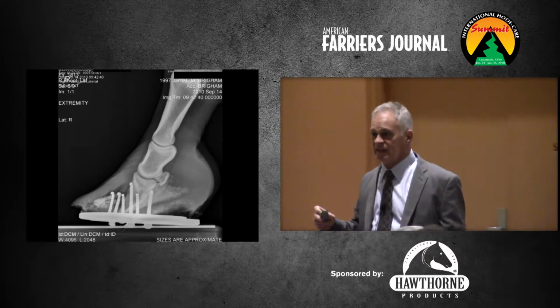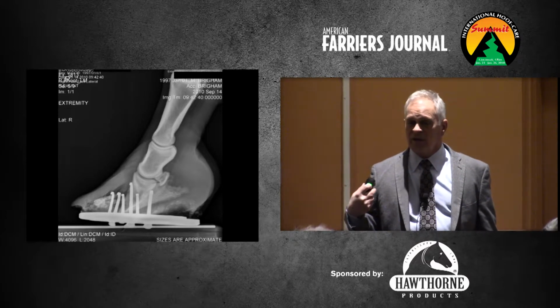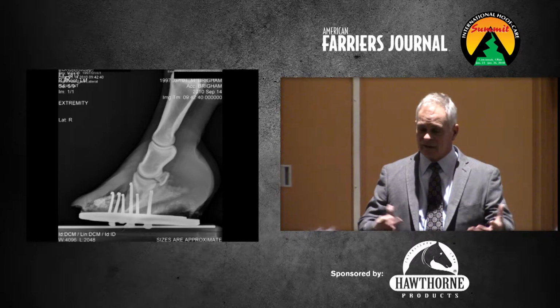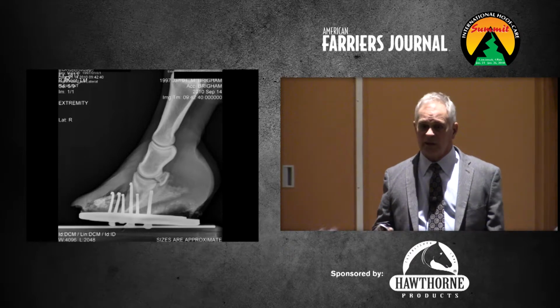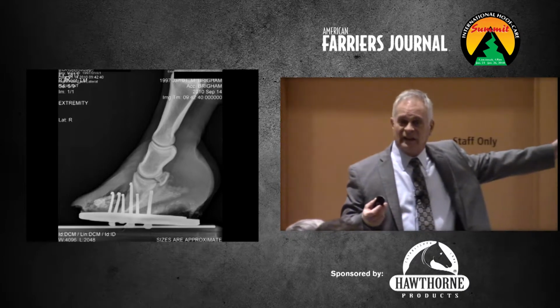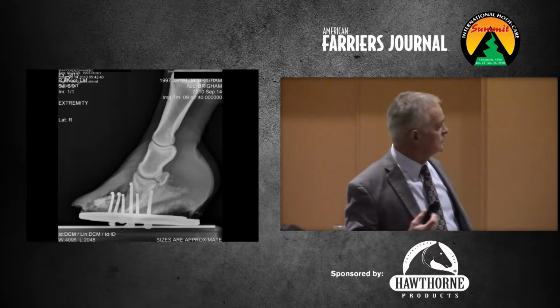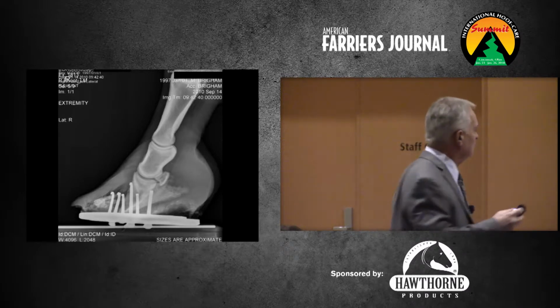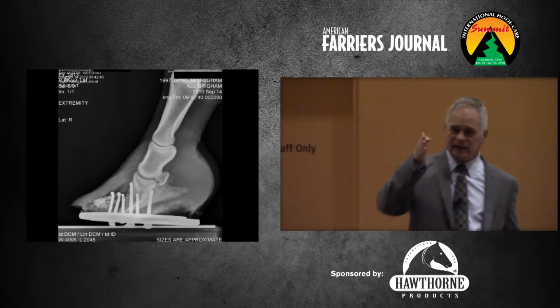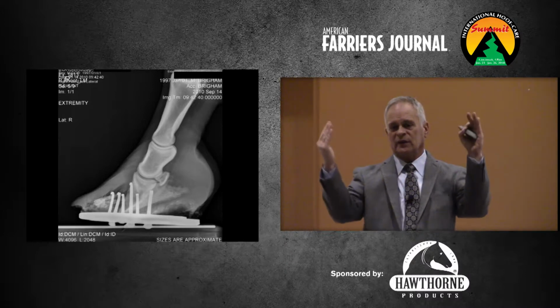That one was basically resected. Everything that was bad came off, and of course there was nothing left to attach a shoe to, so it was put in a soft ride boot, and the owner treated it until it grew enough heel that we could actually glue a shoe on, but then it grew out. But you're likely going to make that horse sore by taking all that off. Okay, so there is dermis covering P3. Remember, when you're looking at this lateral radiograph, it's just a two-dimensional shot. Some of that lucency you're seeing is where it's going around the sides.